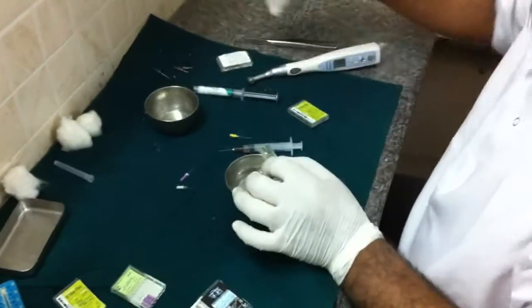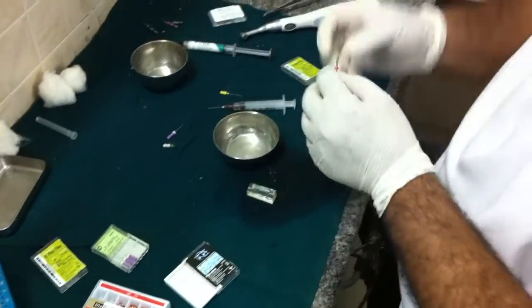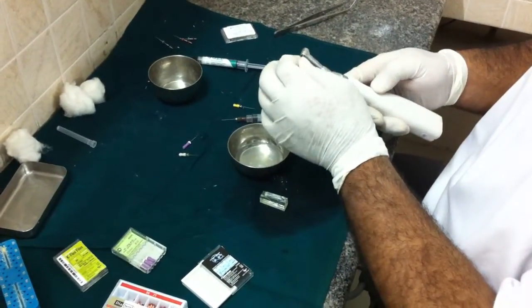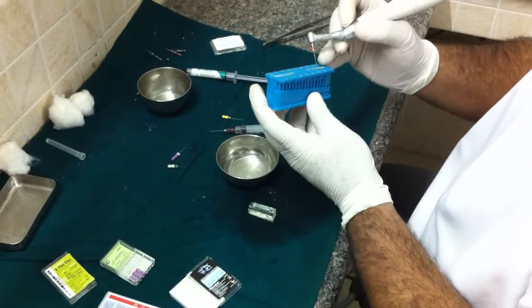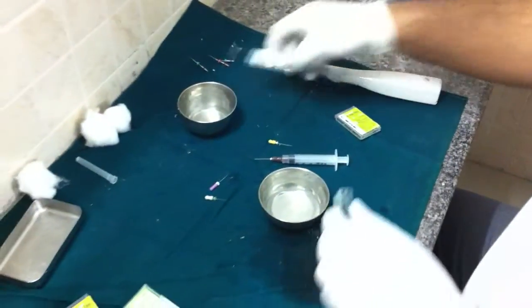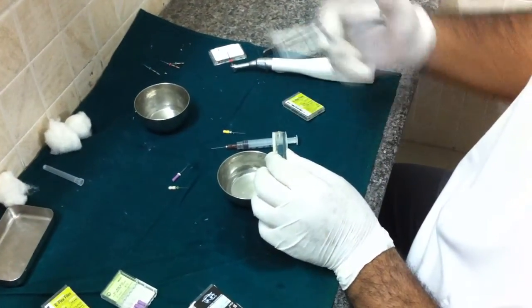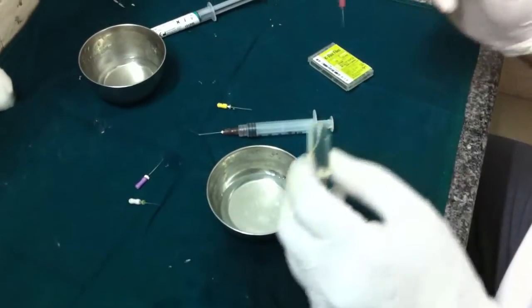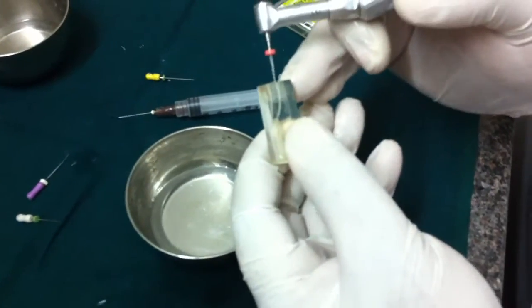Now you come to the last file of the sequence, the 30 6% taper, to the full working length. Introduce EDTA. To the full working length.